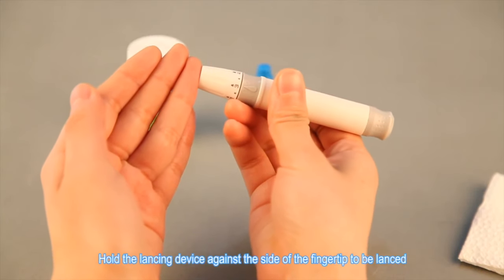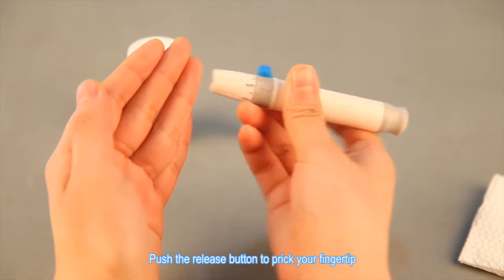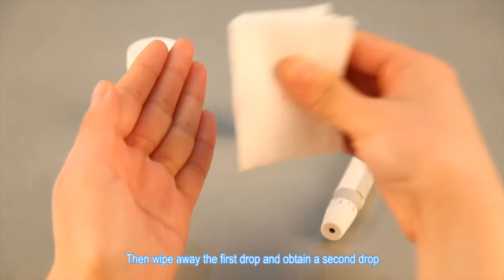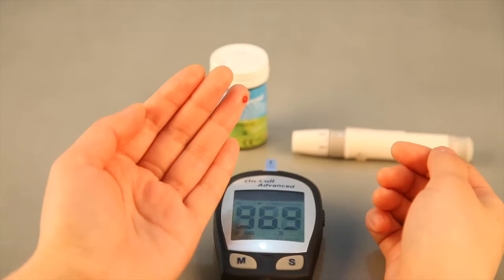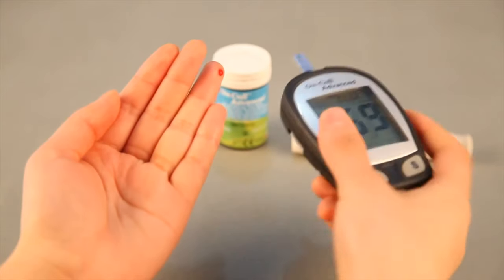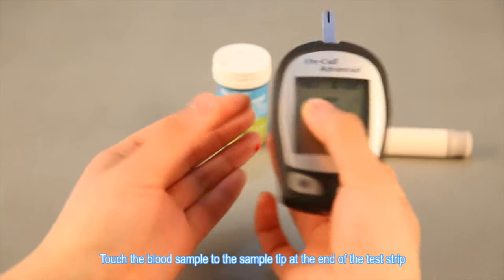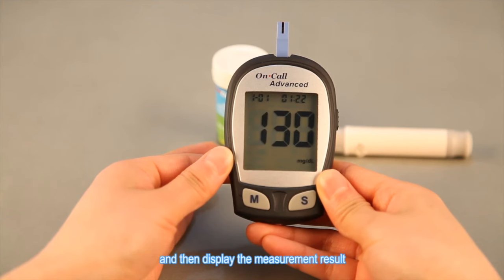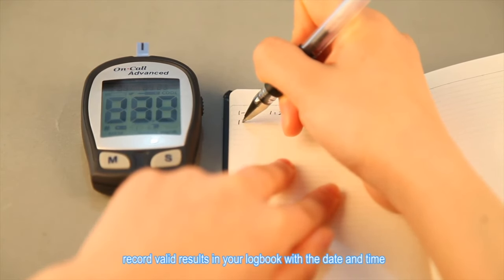The video says: 'Hold the lancing device against the side of the fingertip, push the release button to prick your fingertip, gently massage from the base to the tip of the finger to obtain a drop of blood, wipe away the first drop and obtain a second drop. Touch the blood sample to the sample tip at the end of the test strip. Once a sufficient sample has been applied, the meter will count down from five to one and display the result.' 22.6 — that's insane. It's been high like that before.